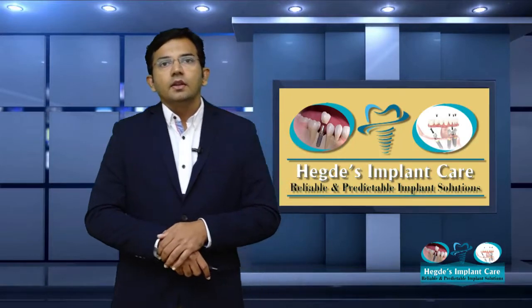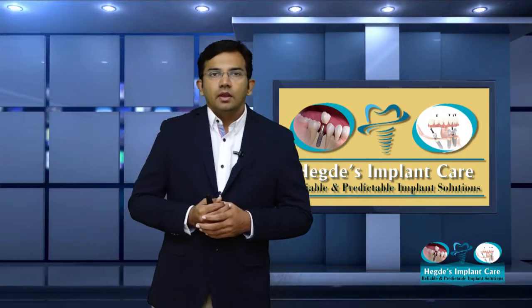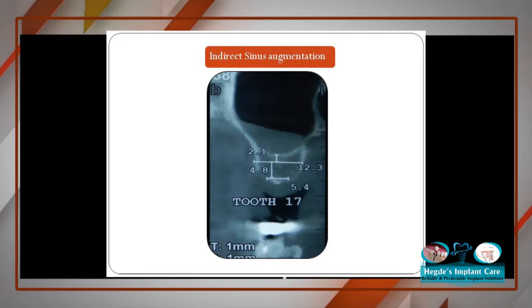I have a case here where in the maxillary jaw there is insufficient bone and we have to place an implant. You can see there are 3 teeth missing. The first one is a broken tooth, or a root stump as we call it. We have to extract that and place the implant, a relatively simple procedure. But posteriorly, we have to place one more implant, and the problem is there is inadequate bone. If you take a look at the CBCT report, we have just about 6 mm of height, but a good amount of width, about 5 to 6 mm. So, how do we go about it?